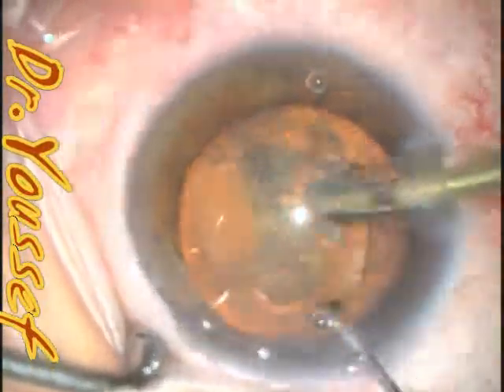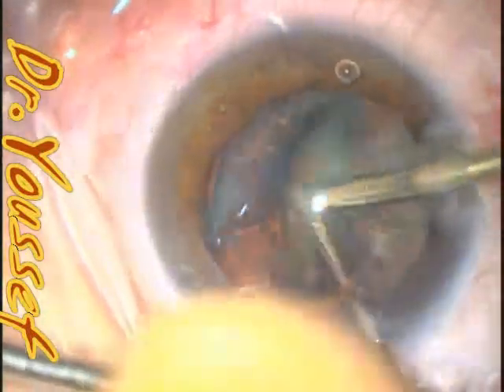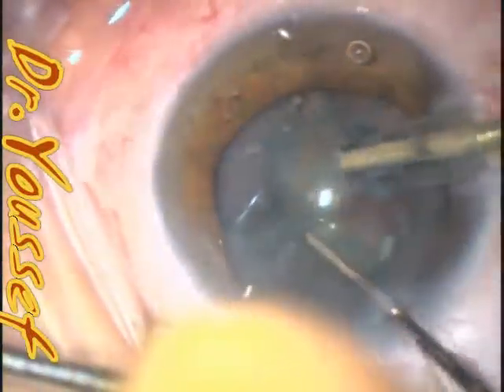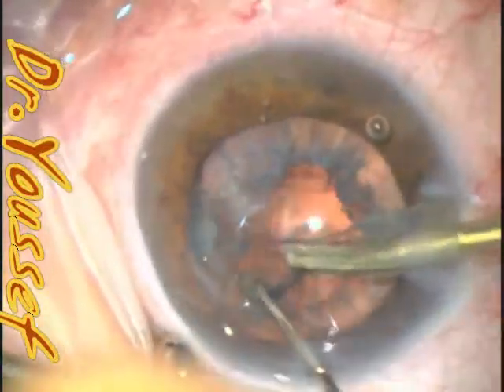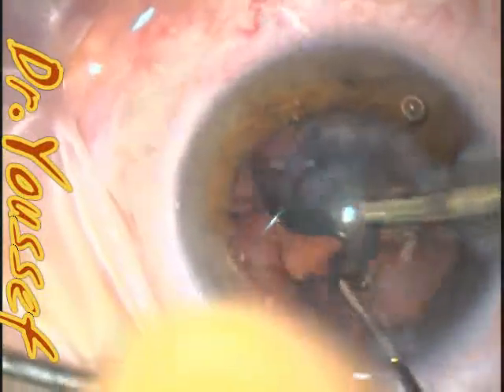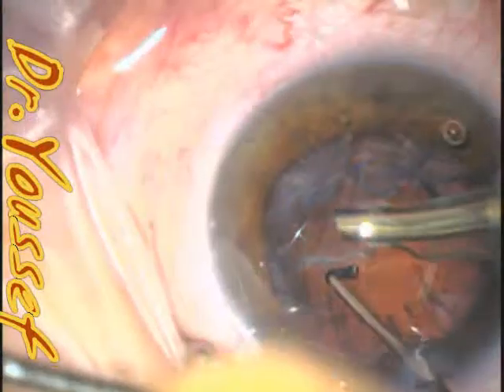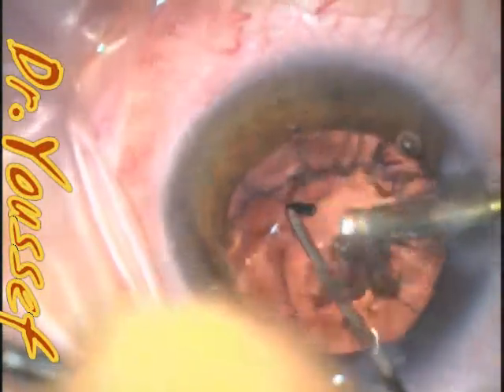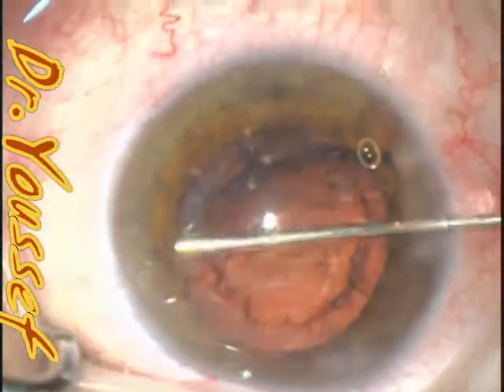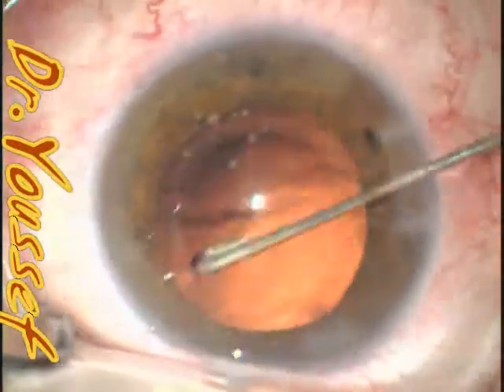So that's the routine case. I'm just speeding up the surgery so that I don't bore you — just phaco chopping, remove the quadrants, the epinucleus removal. And then J cannulas for cortical cleanup. You can see it very efficiently and safely does the job.